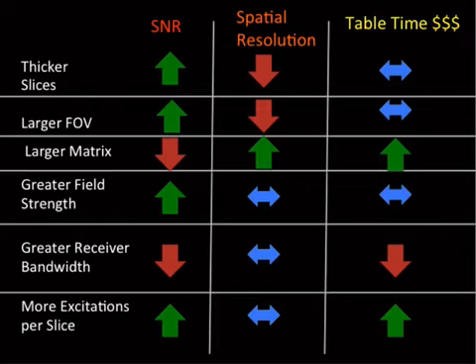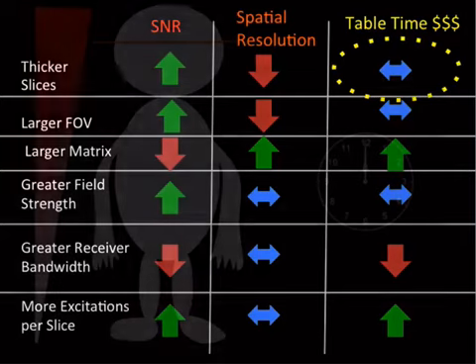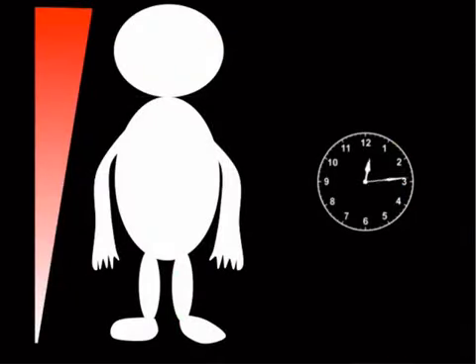Okay, so specifically this point right here is what causes a lot of confusion, because people say, hey, if I'm making thinner slices, that means there's more slices, that should mean there's more table time, but you're telling me that it's not really affecting table time. So let's just review this real fast. This is sort of the concept here: different slices, time is going by as we go through.